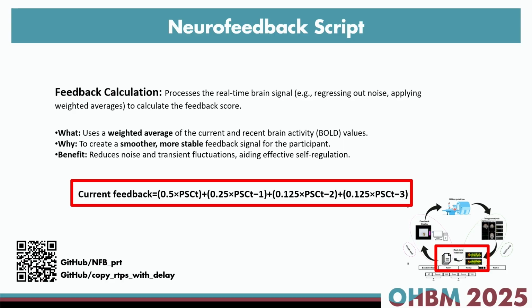It might be a bit jumpy. We found it jumpy in so many of these pilot studies. If you want to present this continuous feedback every 1 second based on the data of only that 1 second, we found it's a bit jumpy. The thermometer just goes up and down, and it might result in a distraction for participants.